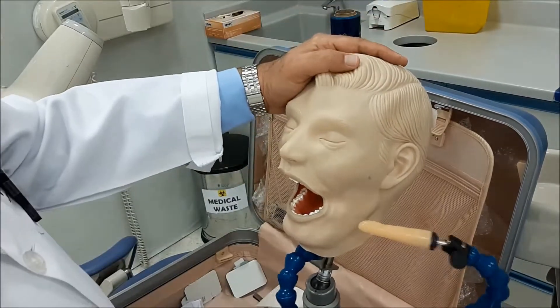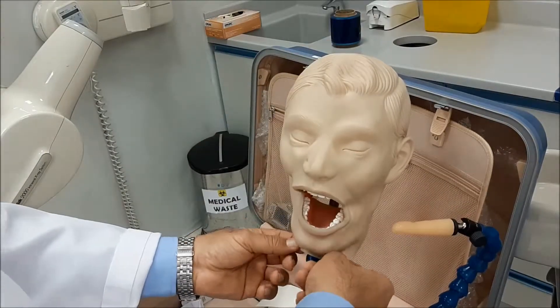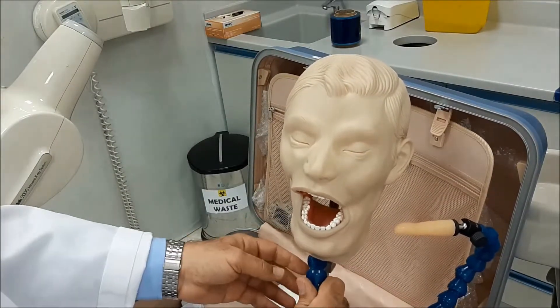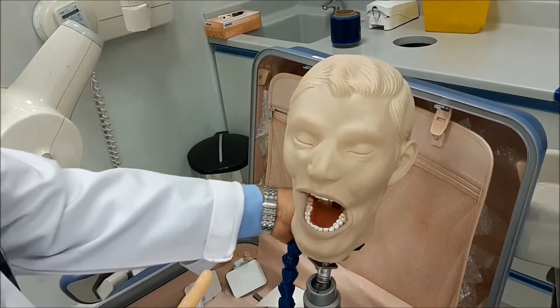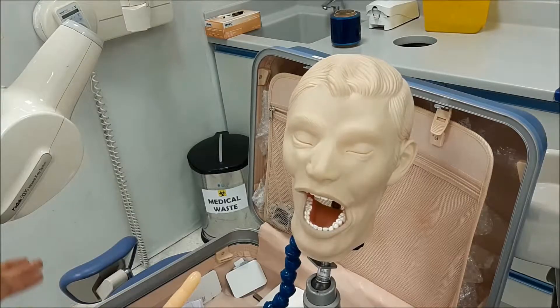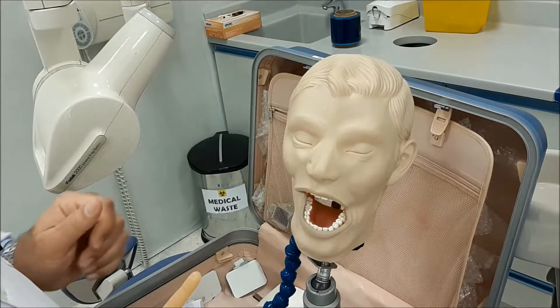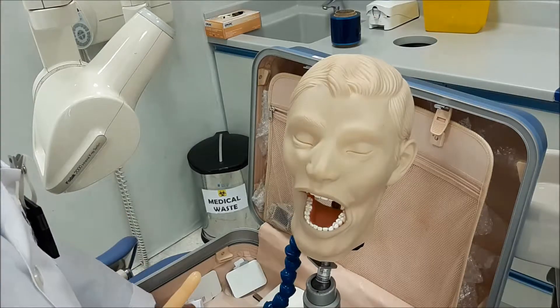The next tooth that we are going to make a radiograph for is the lower canine. Radiographs of the canine should be done separately because of their unique position inside the oral cavity.